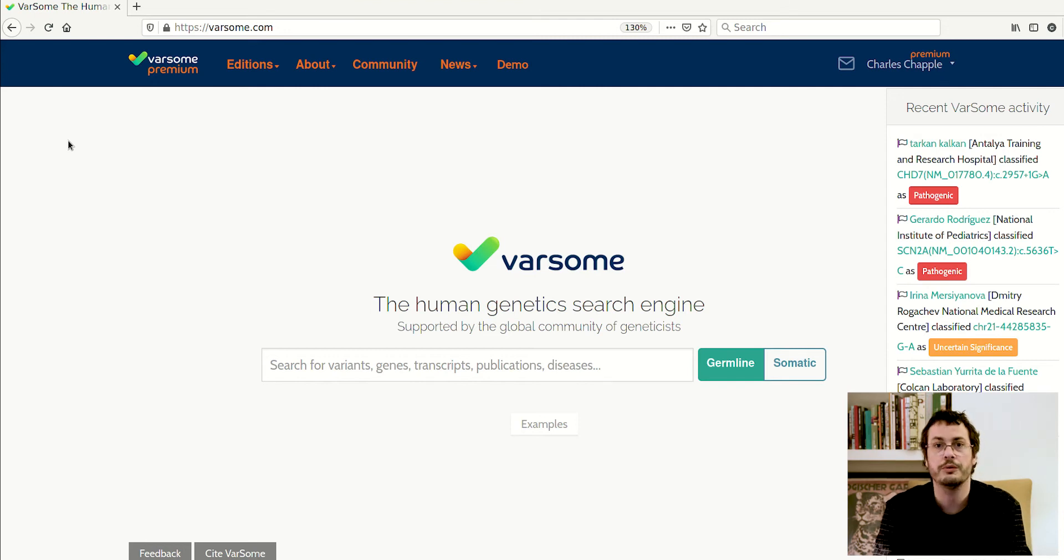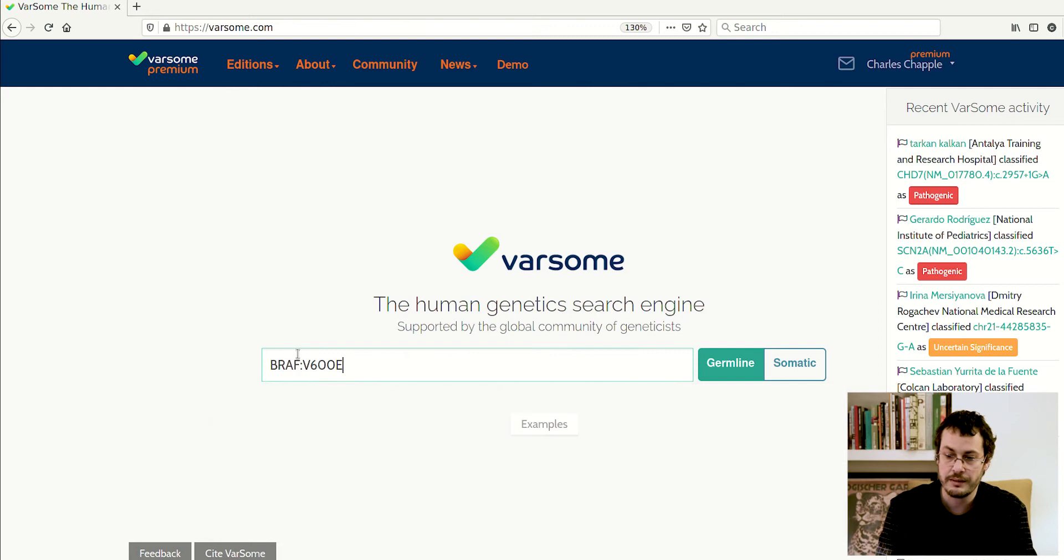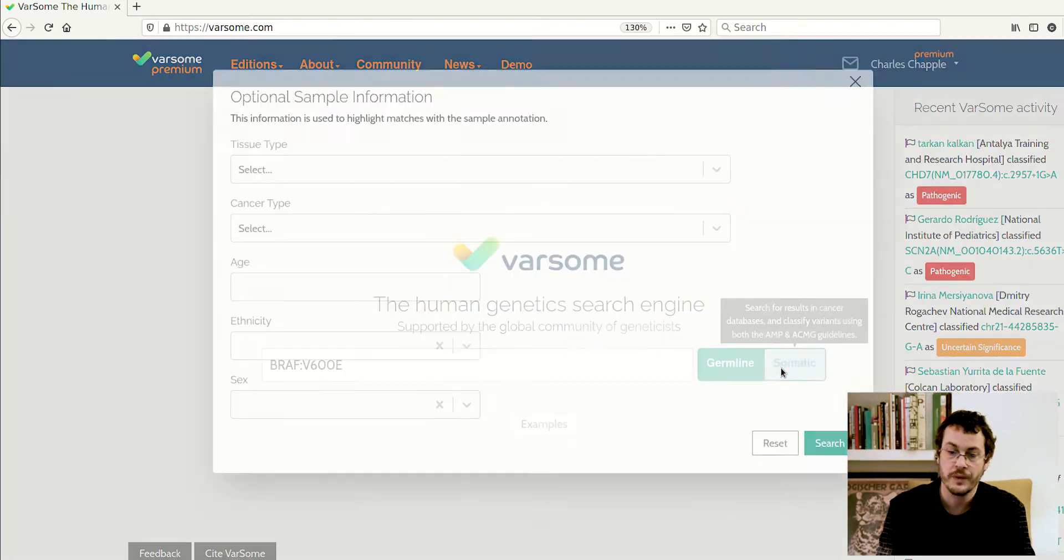First of all, you would go to Varsom.com just as you would normally. You would enter your variant and simply choose somatic instead of germline when you search.